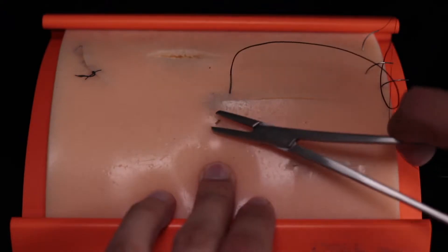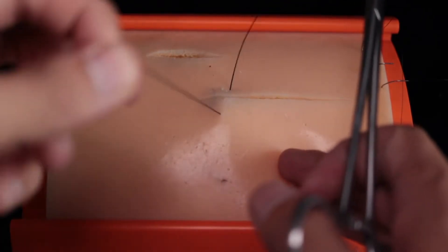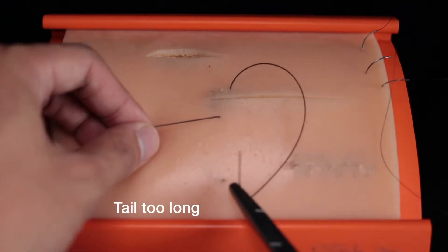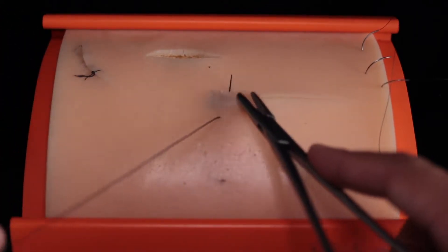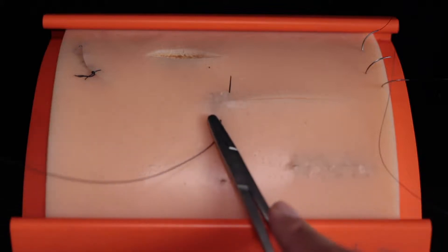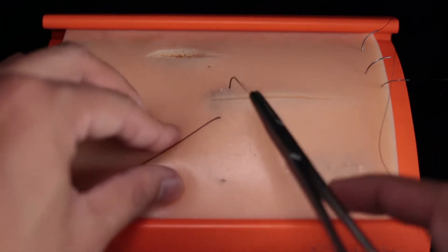After putting in your stitch, you're going to pull the suture through, making sure the end is the right length. Here I'm showing that the tail is too long and that it'll be difficult to handle and tie. On the other hand, this is a bit too short and might make it difficult. This is about the length you want if you want to be conservative with your suture.